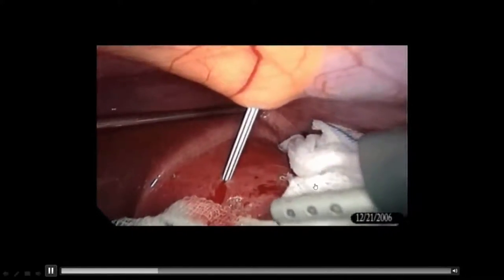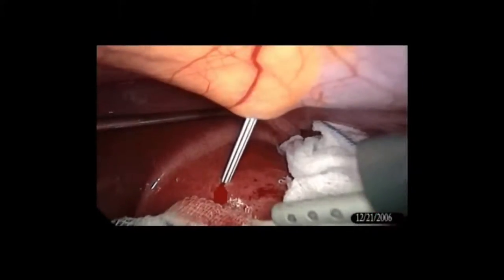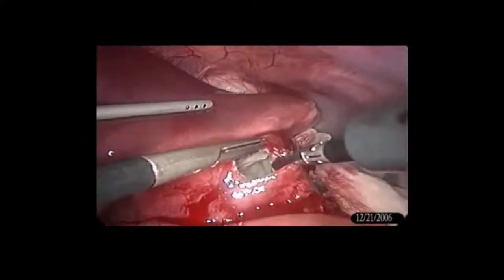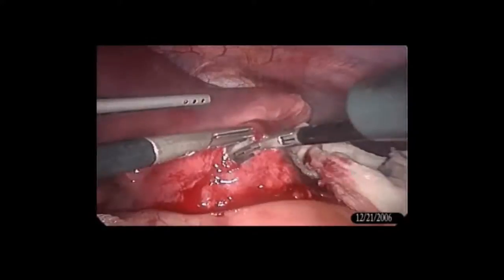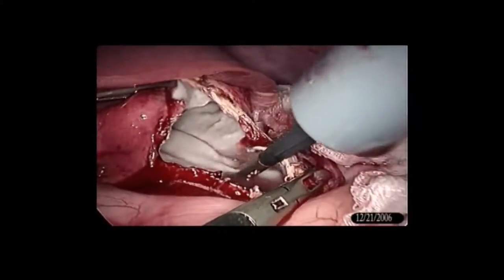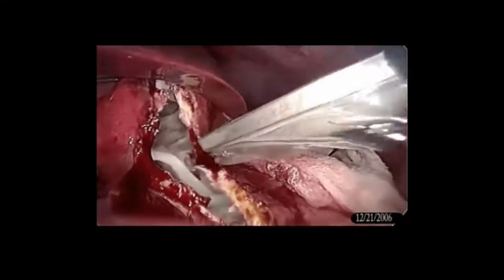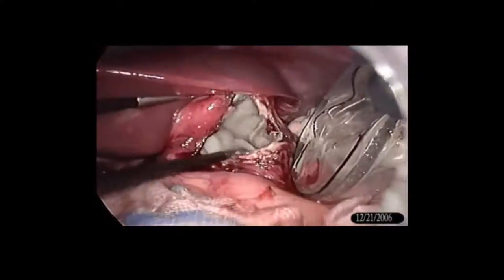Once you have replaced the entire cystic fluid with the hypertonic saline, now you will start cutting the capsule. You can use harmonic or hook and cut the capsule there. We need a good quality endo bag. You cannot expect to use gloves. You should use a commercially available endo bag, and all the germinal layer should be transferred immediately into the endo bag. Most of the time, unless it is infected, this germinal layer comes out relatively straightforward. It will come easily and you will transfer it into the endo bag.